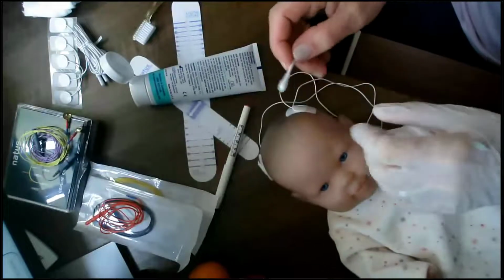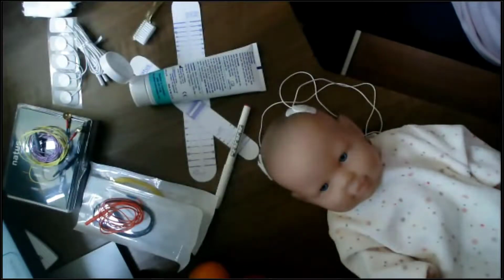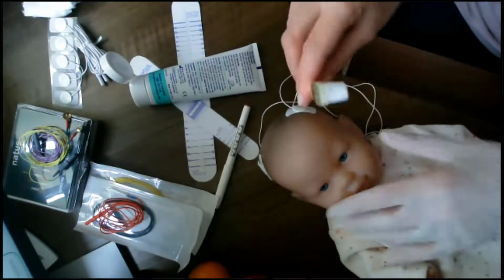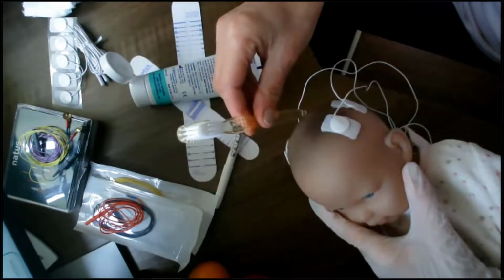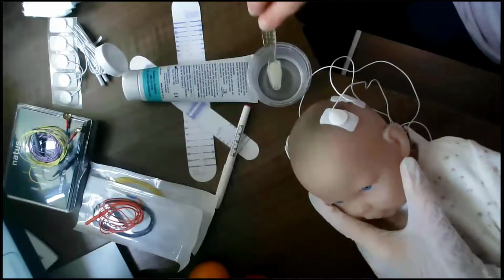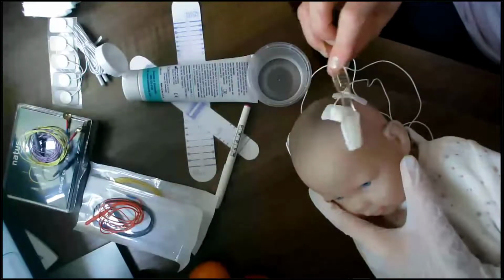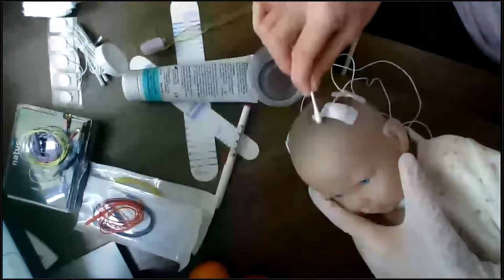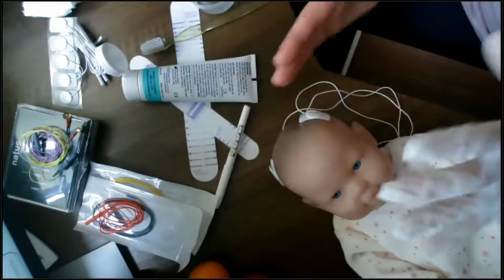Okay, so like I said, you're going to part the hair. This is actually where my toothbrush comes into action. Like I mentioned, if you've got a baby with a lot of hair, you can use a toothbrush very nicely to part the hair. Dip your toothbrush in some water, and then brush the hair from side to side so that you get a direct parting, and it'll be through that parting that you actually clean and prepare the skin.